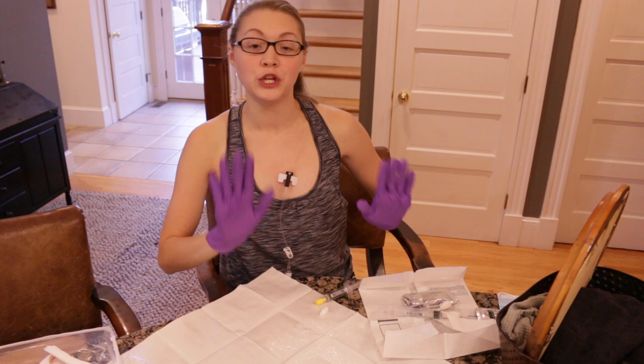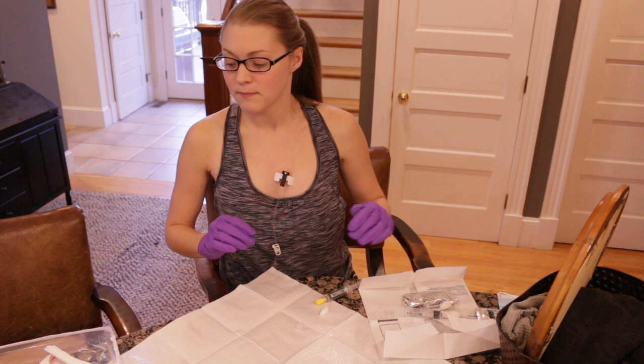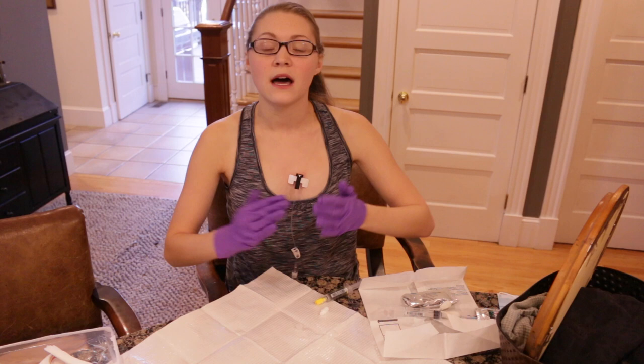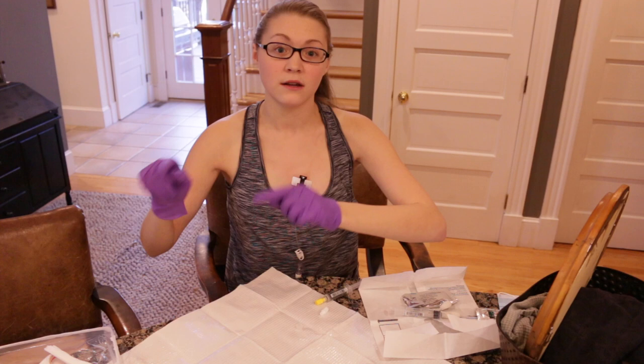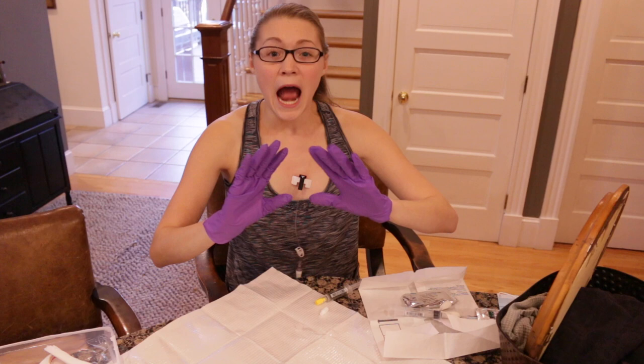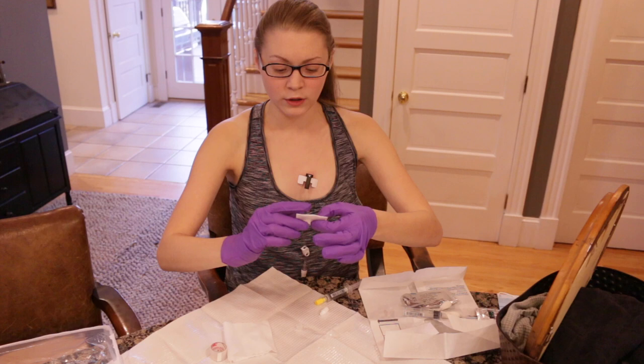This is not the needle I would use if I'm going to be accessed for a week or more. With this needle, for most needles, I like to put a little bit of gauze under the wings of the needle just to cushion it a little bit. It'll depend on how your port sits on your chest whether you need that cushioning or not. There is sterile gauze in the dressing change kit, so that's what we're going to look for — a little piece of sterile gauze. By my preference, I like to make sure that it is folded perfectly. I'm meticulous about that because I figure I'm going to have to look at it for the next week, so I want to make sure it looks good. I'm going to use this little two-by-two and fold it.